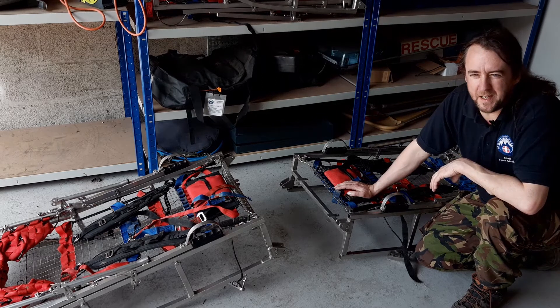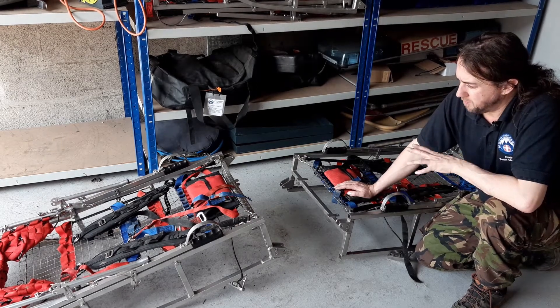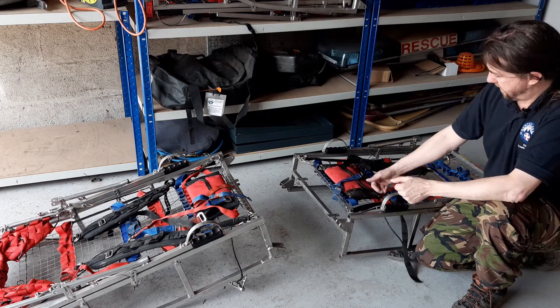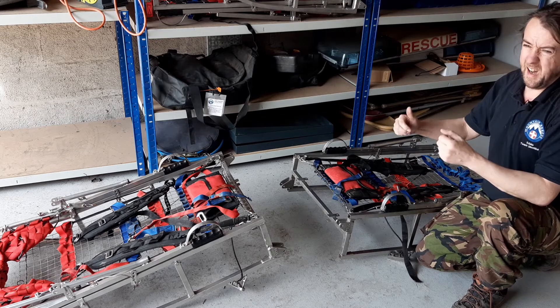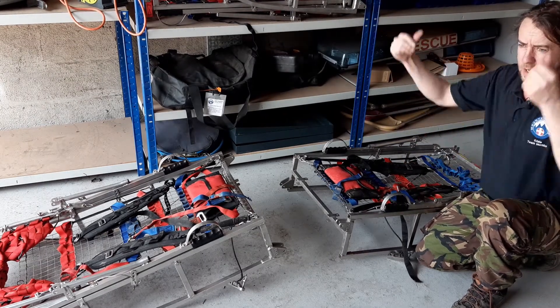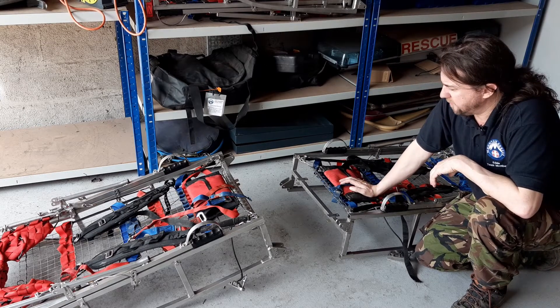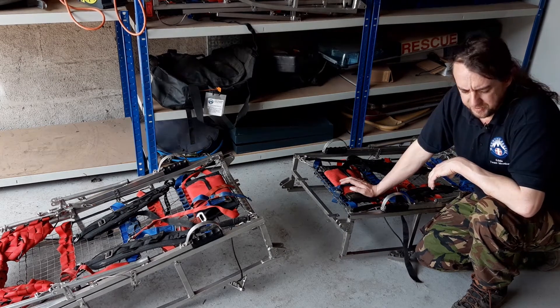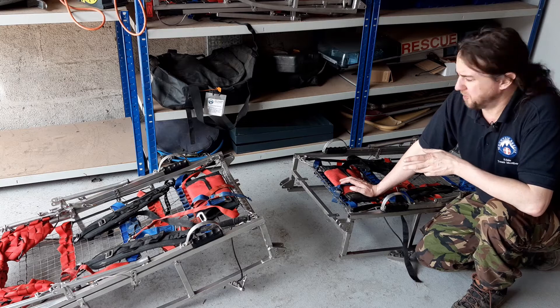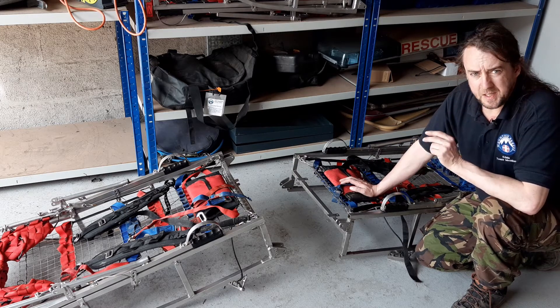Just a quick video on putting the stretcher together. Normally we take the stretcher up to the site - one person holds the bottom end, somebody else puts the top end on, and a third person or the first person screws it all together while someone else holds it. If you're short on people or avoiding close physical contact, it is possible to put the stretcher together on your own - it's just a bit harder and you need to be a little bit more careful.